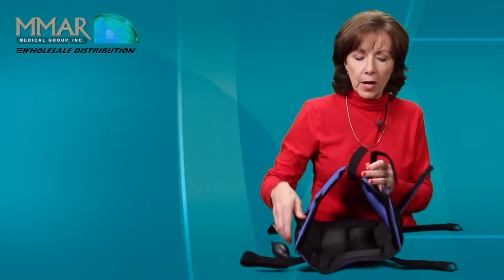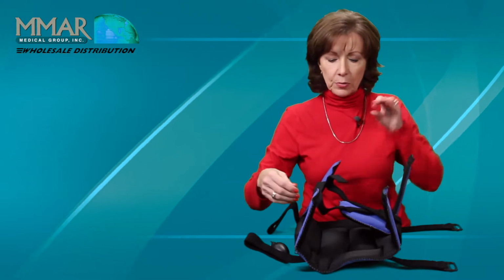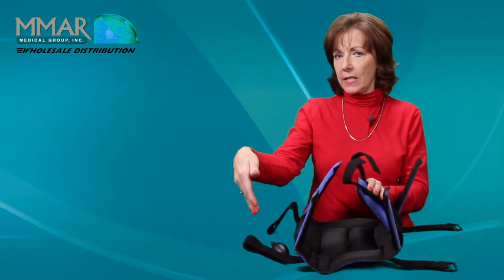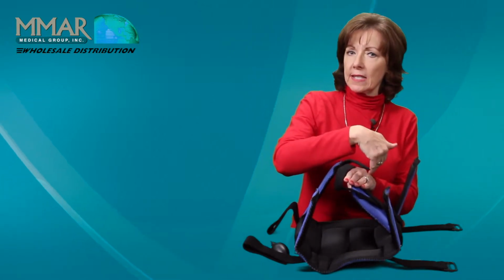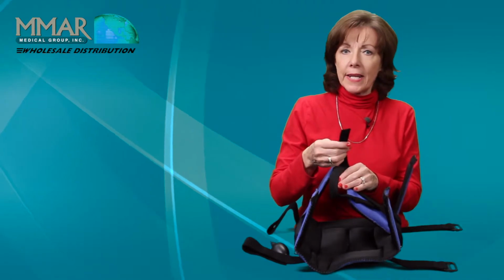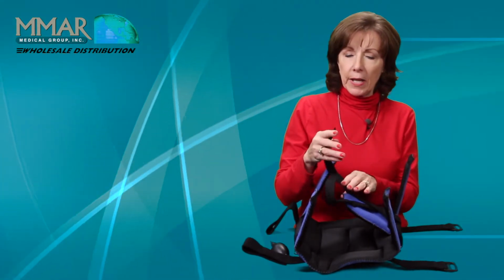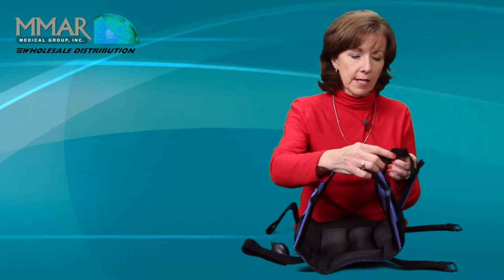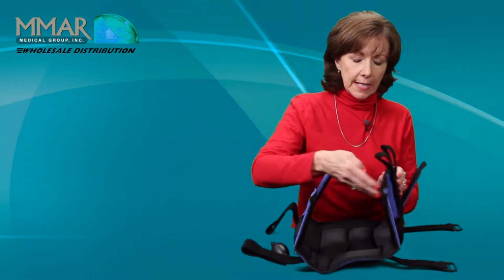Now these come in right and left. This would be a right because all your Velcros go in this way. You want your straps to go to the outside of the knee, not try to bring them on the inside where they might rub the other knee. And it's just hard when you have real contracted patients to get straps between the legs. So let's put them to the outside. Just makes it a little easier.